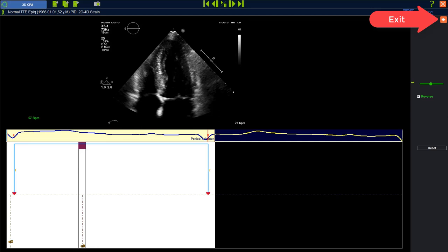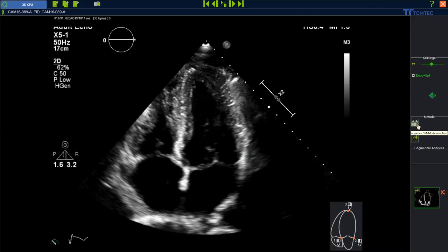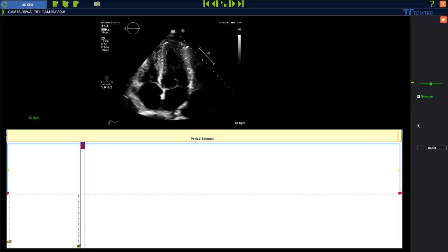Leave the menu using the right upper corner. Second example: in this case you can see we have no ECG information transferred from the machine as DICOM information, so we have to set the ECG manually.